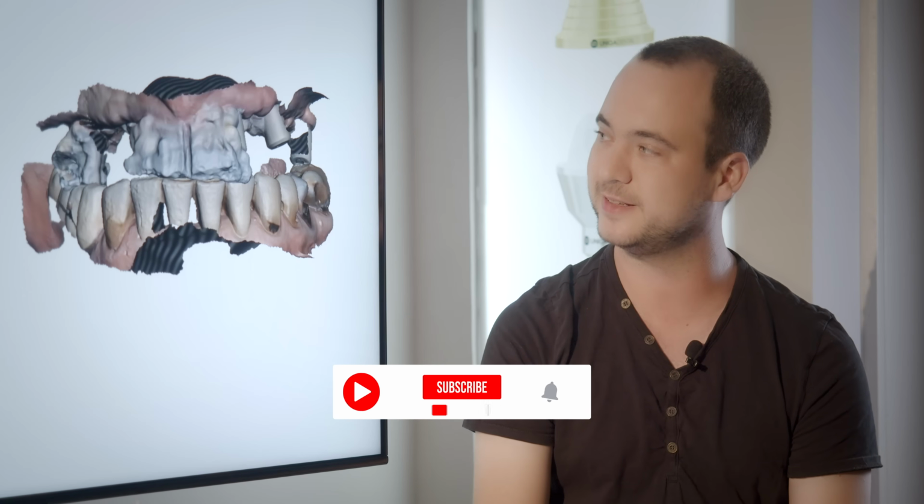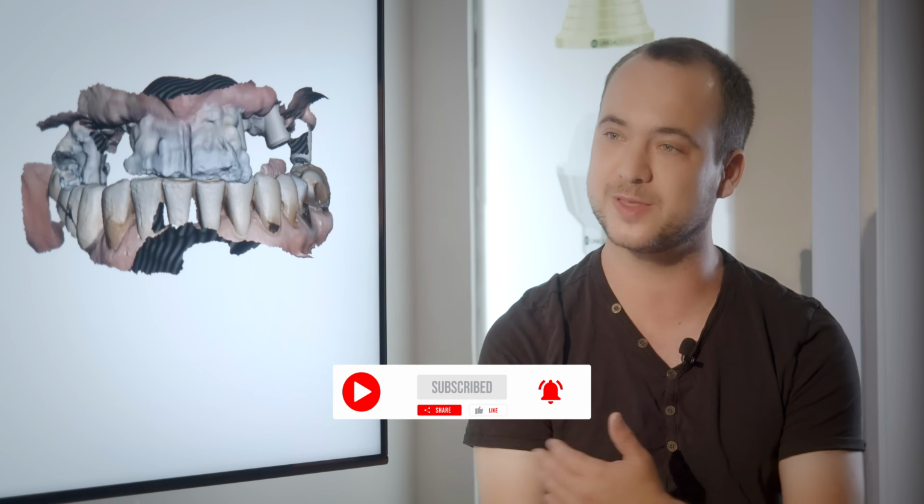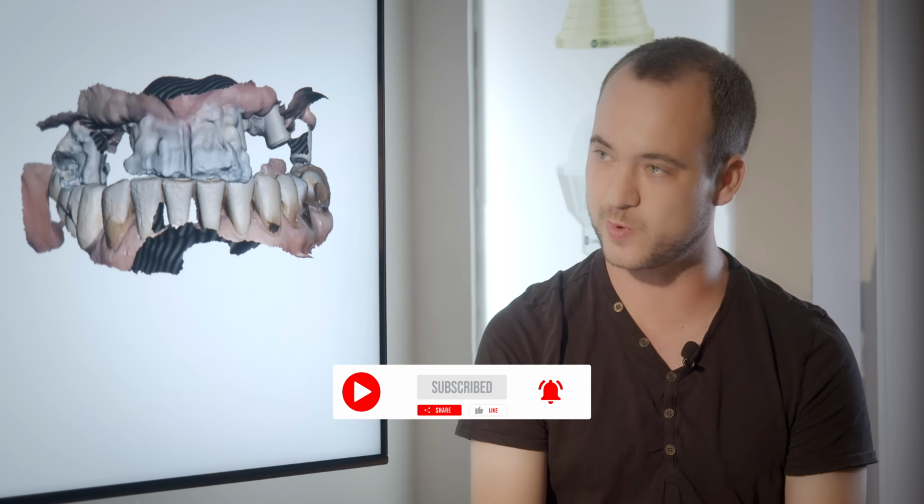So here, when we use the composite material, we just cover the lower teeth. We know the height that we want. We can see how the patient closes his mouth, his lips, all the soft tissues. And this is how we know what to do. When you use wax, in most cases you use a very thick plate of wax, and you don't have any soft tissue management. You don't know how the lips would be. No, the height you know, but you don't know how the soft tissues are in relation to the wax.